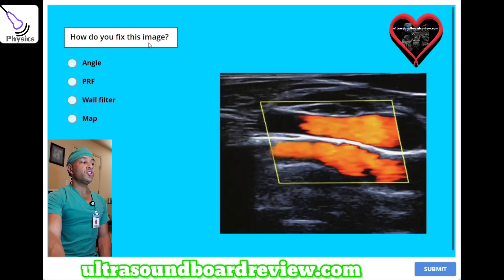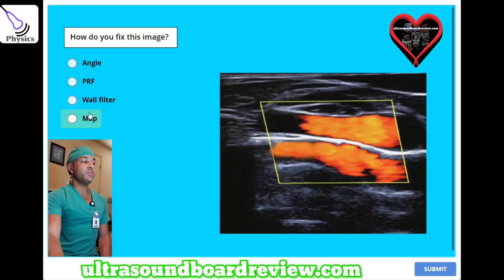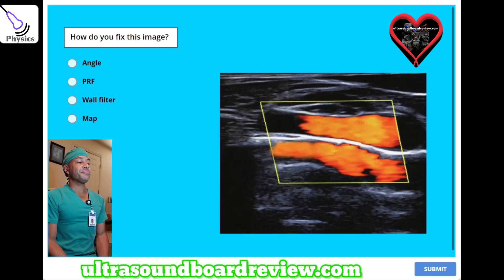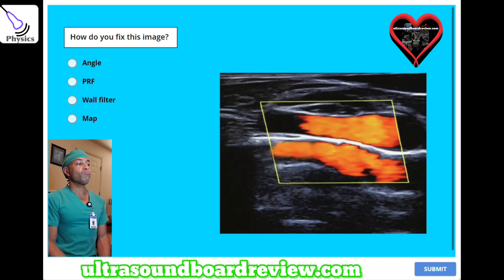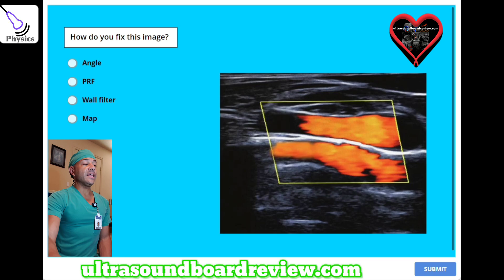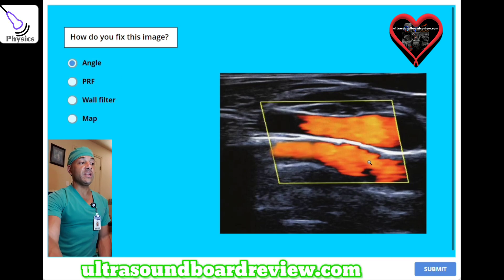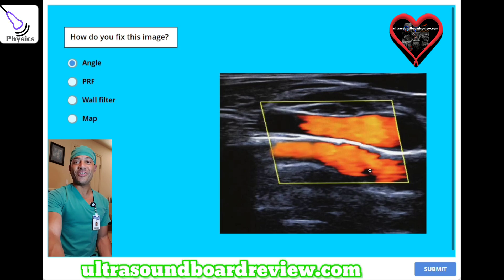How do you fix this image? A, angle. B, PRF. C, wall filter. Or D, MAP. The answer is A — angle. This is a color Doppler mirror artifact, and changing the angle will help reduce this artifact.